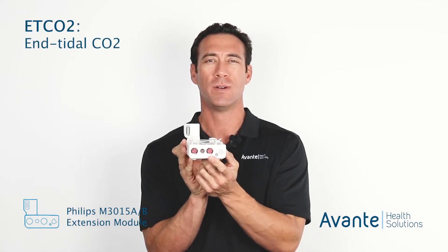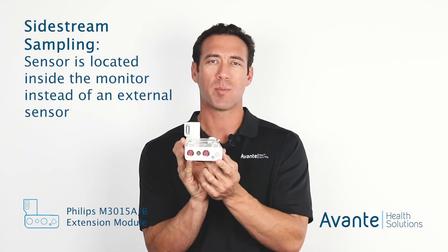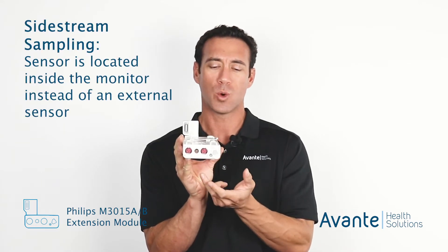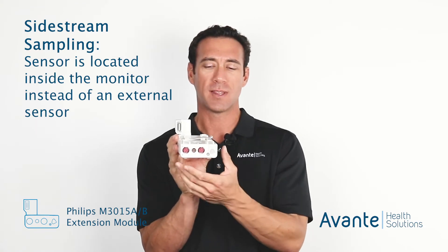This one is going to measure ETCO2, and the way it's going to measure is it's going to use sidestream sampling. They also coined these microstreams — so microstream and sidestream are going to be the same thing.